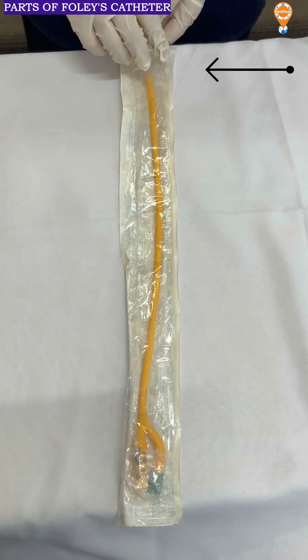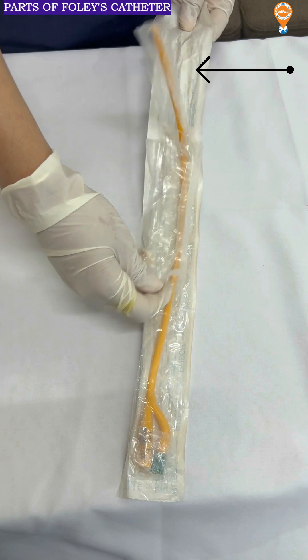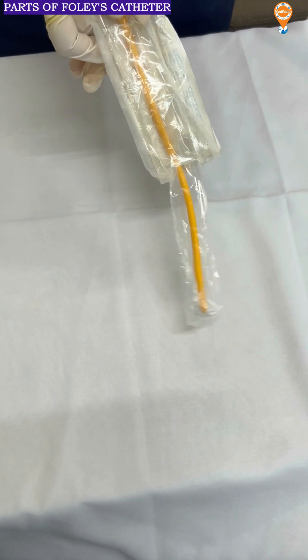This is a Foley's catheter. You have to always open it from this side. As we open it from this side, it is a sterile procedure where we are keeping it into the tray in this way.